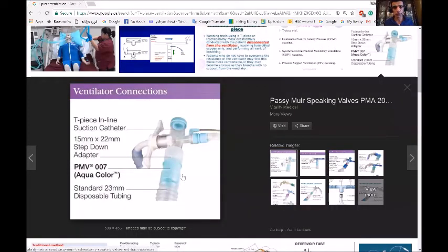Do you see this now? Yes, exactly the same. Here is this piece connected to the mask and this one connected to a pressure generator oxygen at the same time. This one has a valve you can see, so you can send this valve to achieve a PEEP.